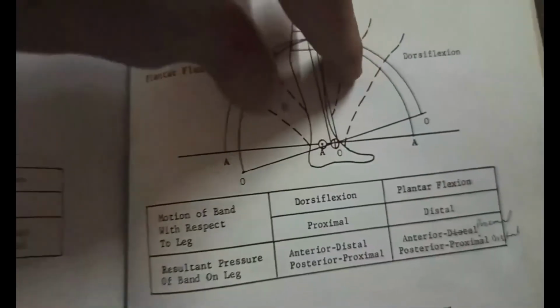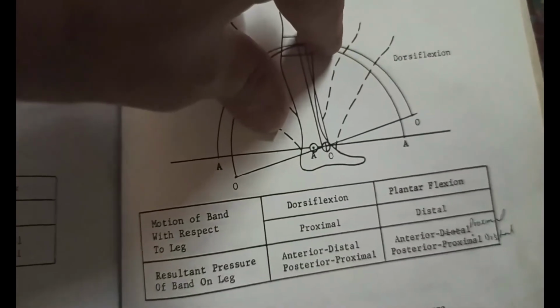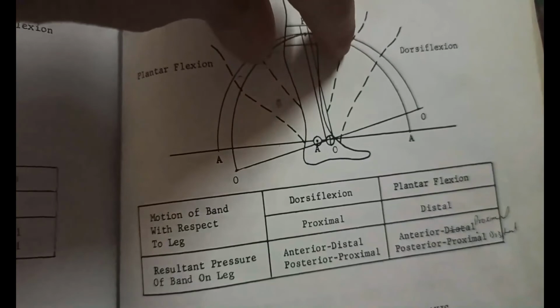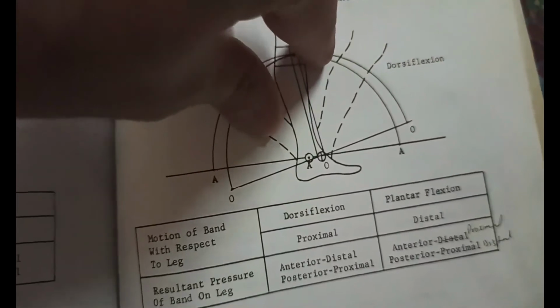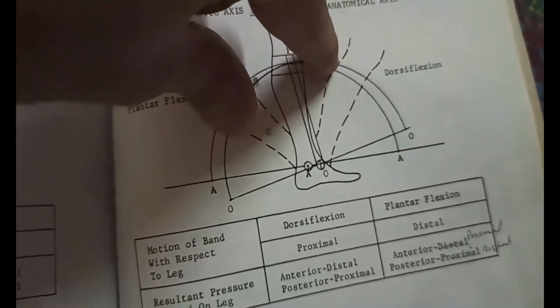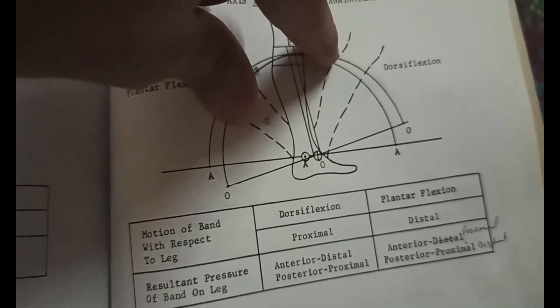For plantar flexion, as it is motion of the leg posteriorly, the band will move distal, meaning below, and tilt like this, which means my finger is above while my thumb is below. This says that the pressure at the anterior end will be proximal and at the posterior end it will be distal, as I corrected here.